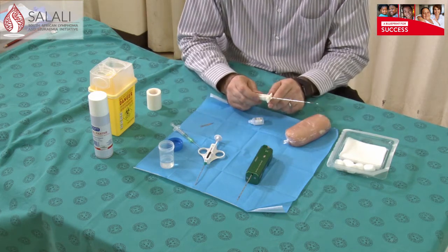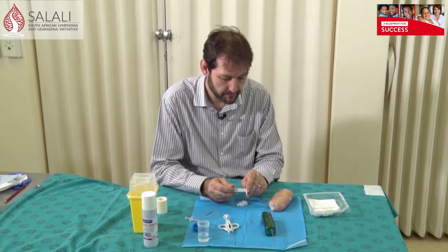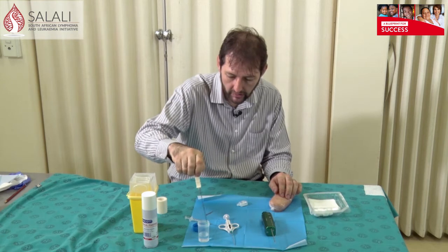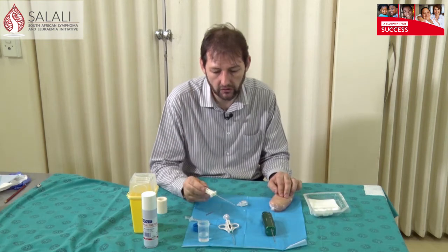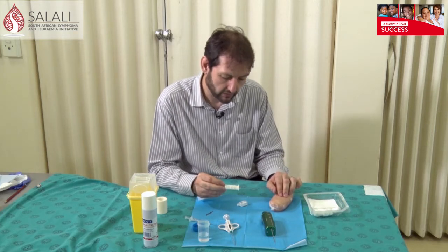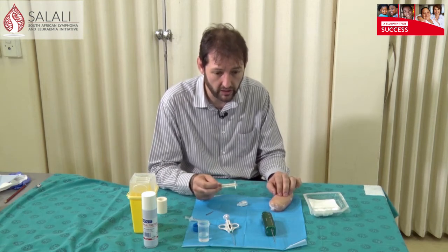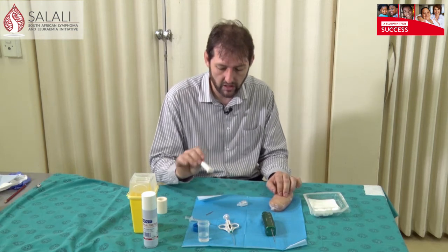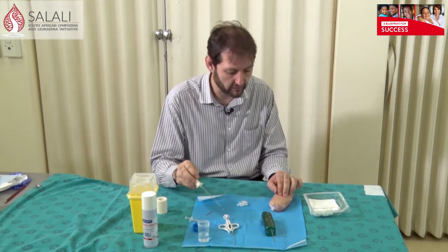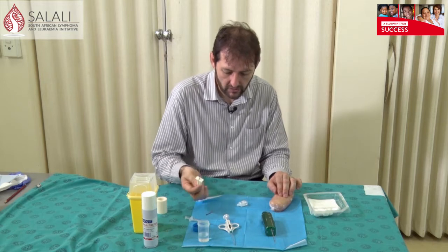The specimen can be put into the formalin, and if you want to take another biopsy you repeat this process. What you need to guard against: never put your needle into the formalin and rinse with formalin to get your specimen in, then go back into the patient. Formalin is very caustic to tissues — you're going to get tissue necrosis, tissue reaction, and it's going to be really painful for the patient. Never put your needle into the formalin and go back into the patient. You can do that when you've taken your last biopsy to rinse off the needle, but not before. Just drop the specimen in with a needle or instrument into the formalin.